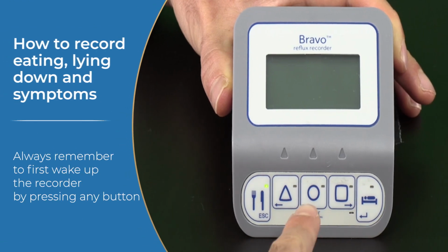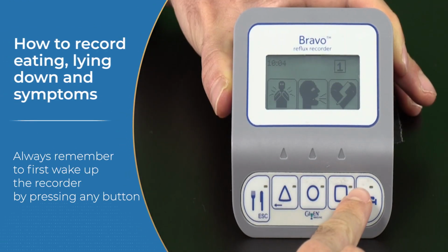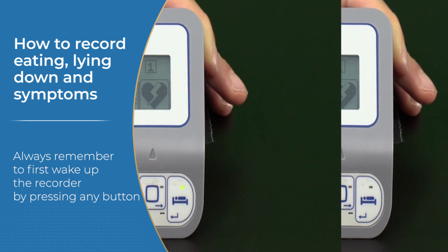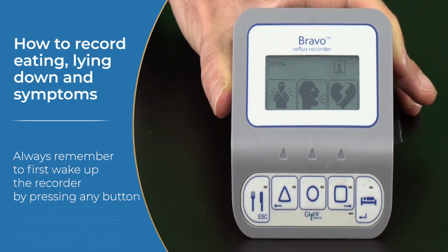You will also use the Bravo recorder to mark when you lie down at a 45 degree angle or less, and when you get up. If the display is dark, wake up the recorder by pressing any button. When you start lying down, press the bed button. A green light flashes. When you get up, press the bed button again. The green light goes off.